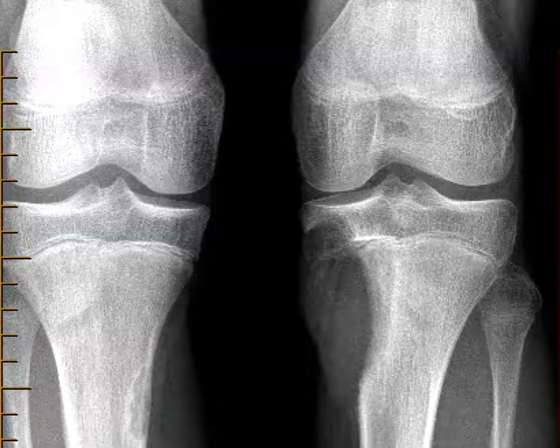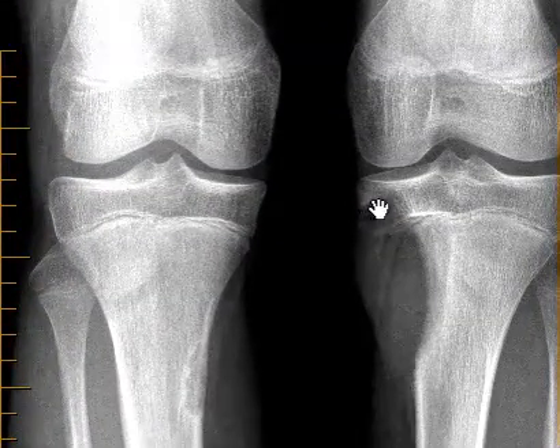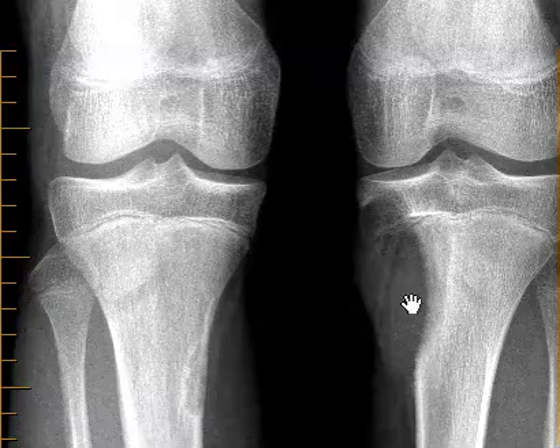Hello, this is Dr. Gay from First Psych MRI. This is a 14-year-old male with complaints of knee pain for about six months. He finally came in to get an X-ray, and they see that the patient does have a well-defined lytic bone lesion in the tibia.